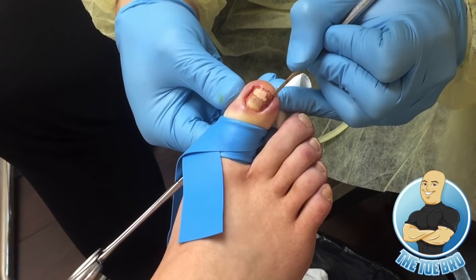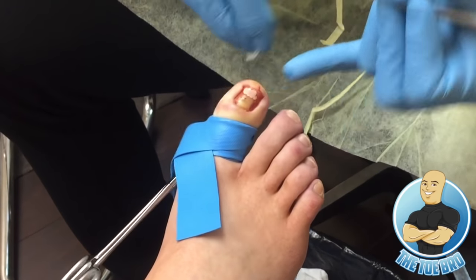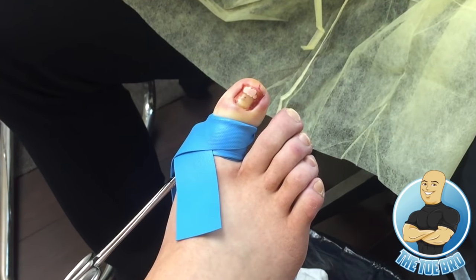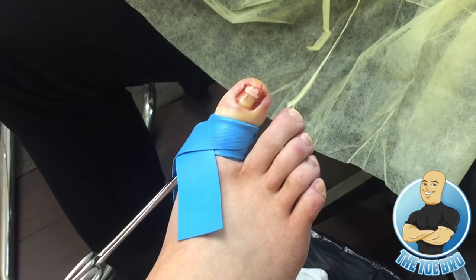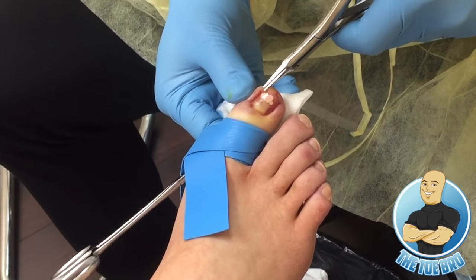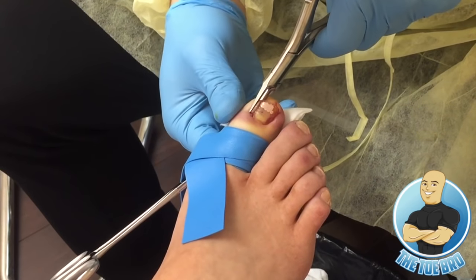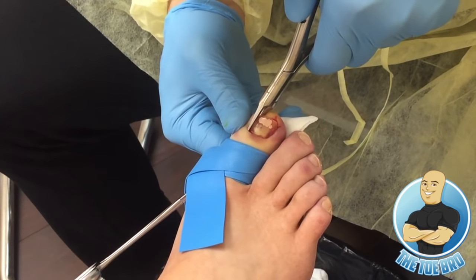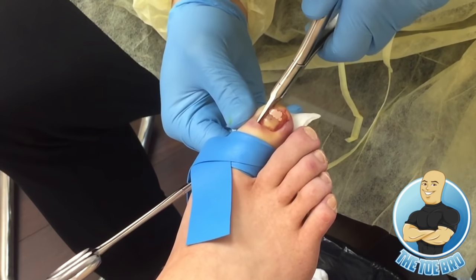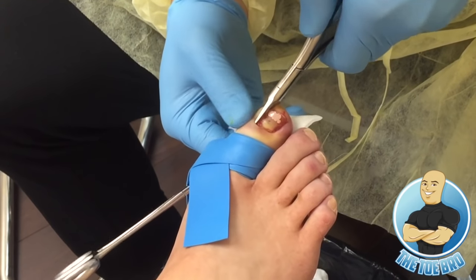After preparing the ingrown portion of the nail and separating it from the nail bed and the cuticle, I'll be using a special nail cutter to cut the ingrown portion out. So this is the tricky part. We don't want to take too much of the nail, or it might not look cosmetically appealing, and we don't want to take too little of the nail, because even if we use the acid, we still might get a recurrence of an ingrown if the nail is still too wide.